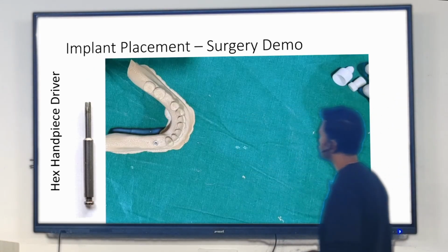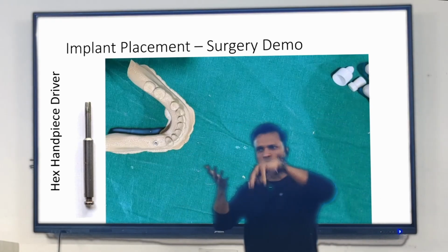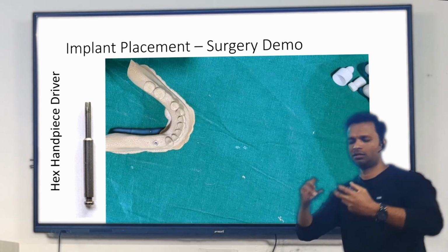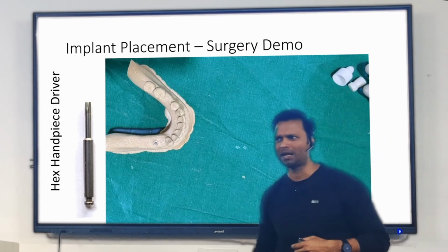That will come under complications. So if we leave the implant like this, just open, it is open from the top, where we attached the implant driver. It is open, it is hollow, the implant is hollow.